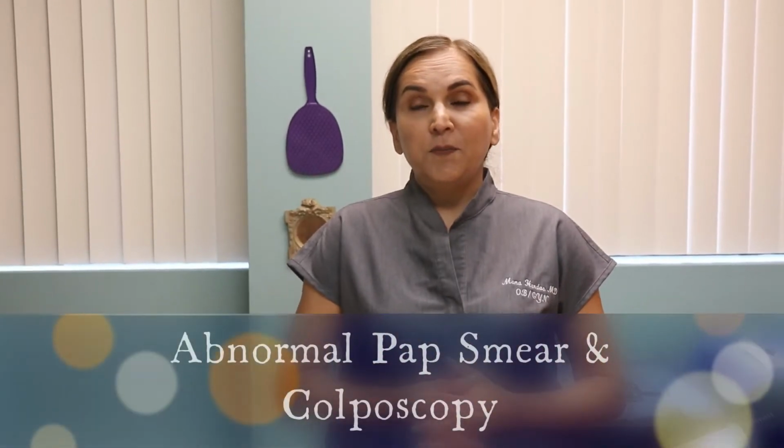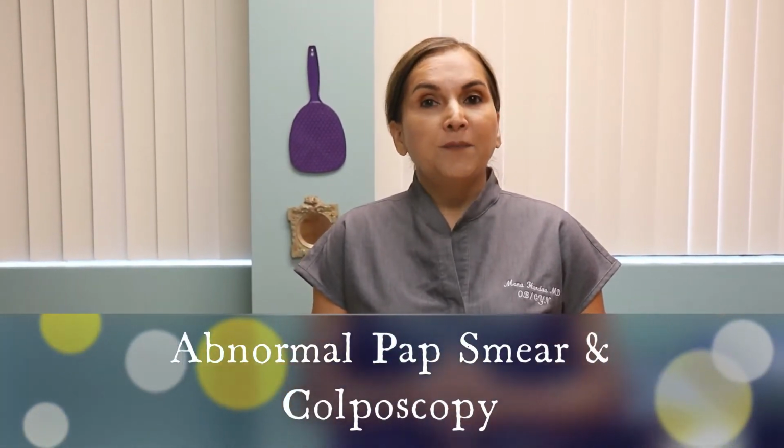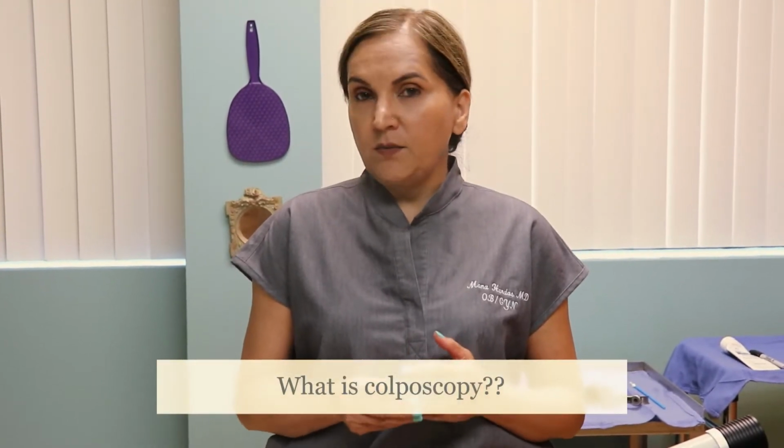You have an abnormal pap smear, and that's why you were referred to me. The pap smear is usually done as a screening test for cervical cancer. So for diagnosis, the next step is to do something called colposcopy. And I told you, you need colposcopy. And here you are freaking out about colposcopy. So let's talk about what is colposcopy.